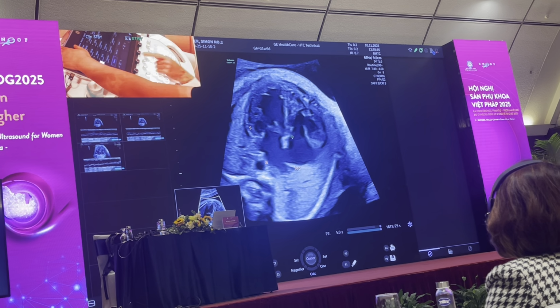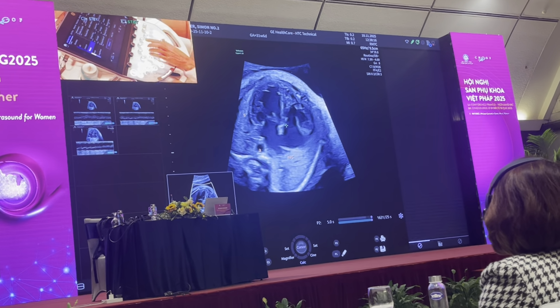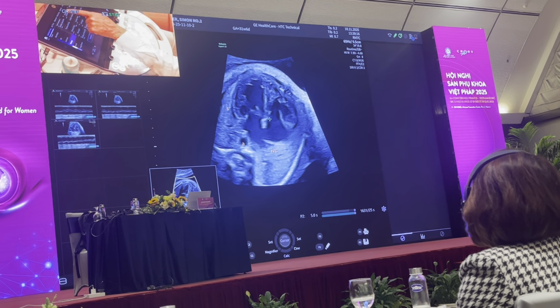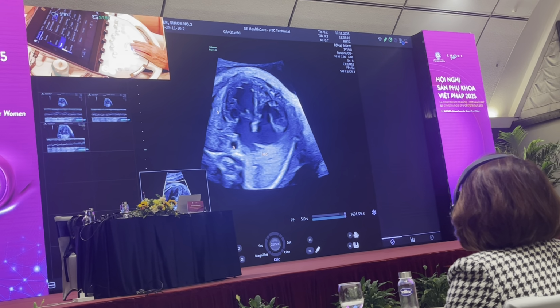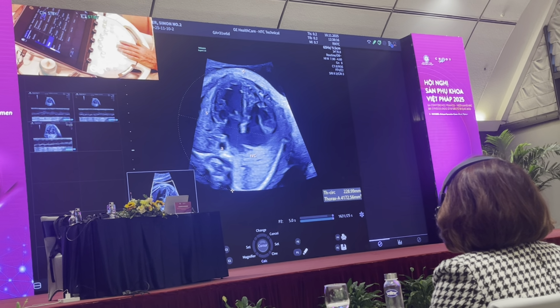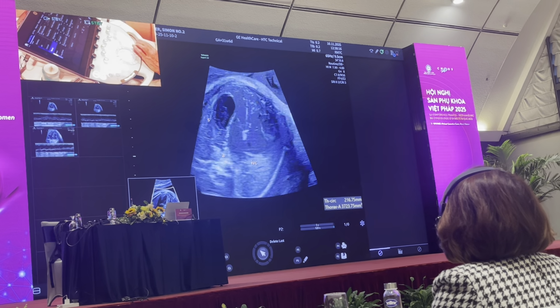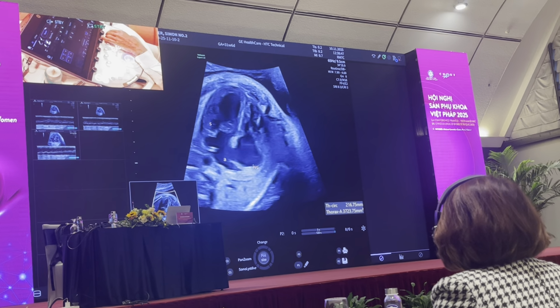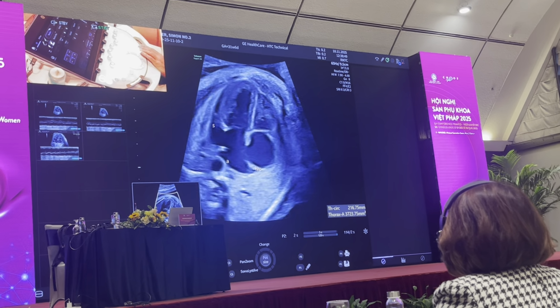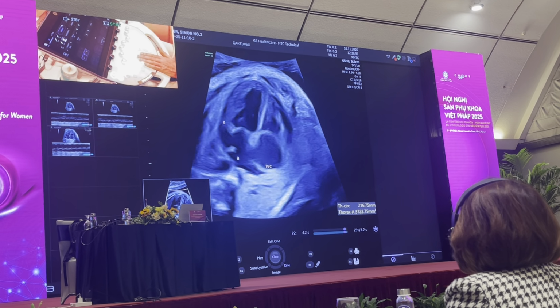Okay, cardiac thoracic, so take the thorax. We can take a measurement of the fetal thorax, so take the thoracic circumference, because I think the cardiomegaly is best looked at objectively. Come across on that, like that. And then I take a measurement of the cardiac circumference. When I look at that, there's mild cardiomegaly with a rhythm disturbance.